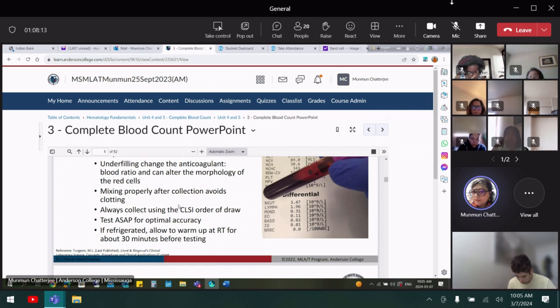But now all hospitals are mandated to have the advanced autoanalyzer because you need the stat results. For Gamma Dynacare, this is not stat, right? They are doing routine blood tests. So till now, they haven't bought the advanced one. When their autoanalyzer breaks or something, then maybe when they are buying, they are going to get the advanced one.